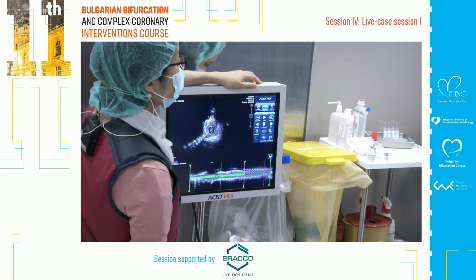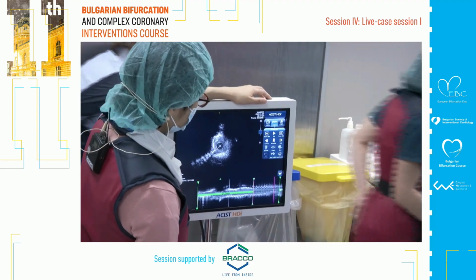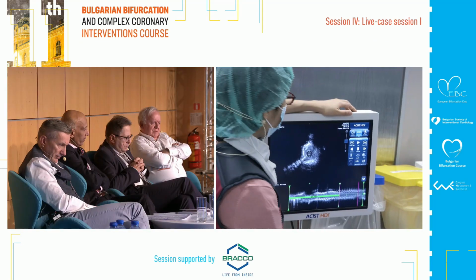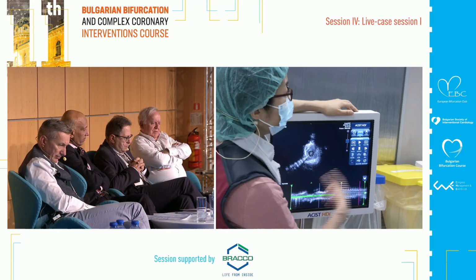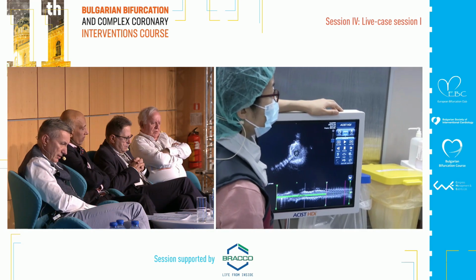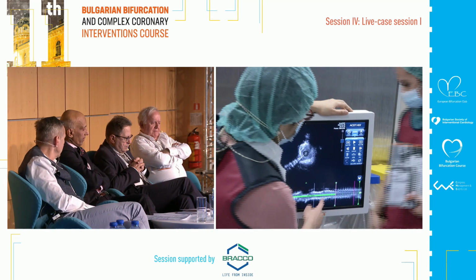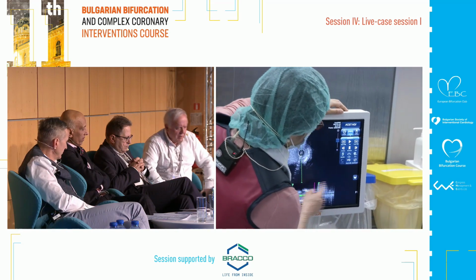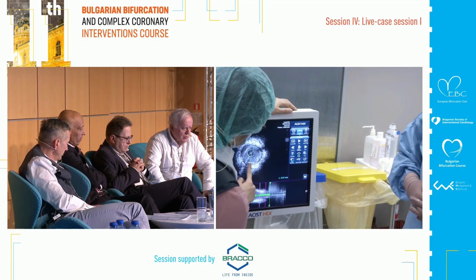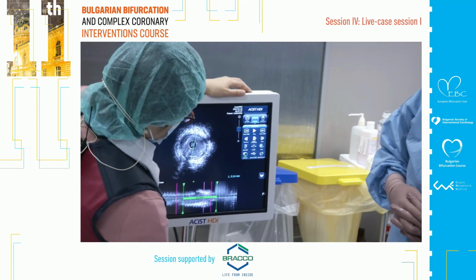Yeah, I think so. But why not one long stent? Crossover, one long stent? That's also possible. Distal is 2.5, and then the left main is actually 3.0. No, this patient's left main is not super big. You see? You can put one long stent and post-dilate.